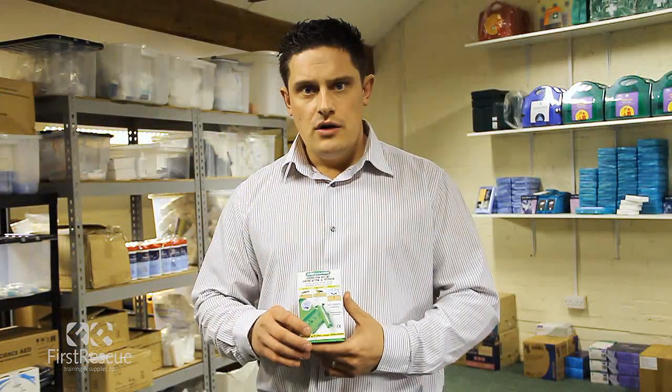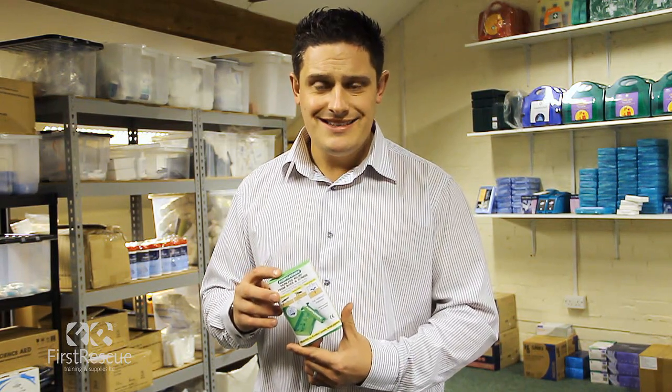Hi, my name is Craig Ward from First Rescue and today we are going to demonstrate the use of an Aspivenin, which is a vacuum pump used for treating bites and stings.